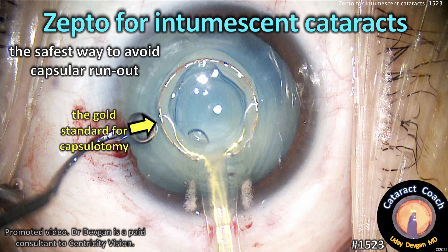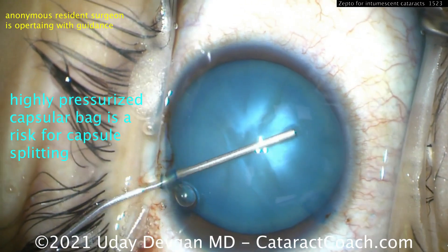CataractCoach.com. Zepto for intumescent white cataracts. This is for sure the safest way to avoid a capsular runout, and it's the gold standard for capsulotomy.